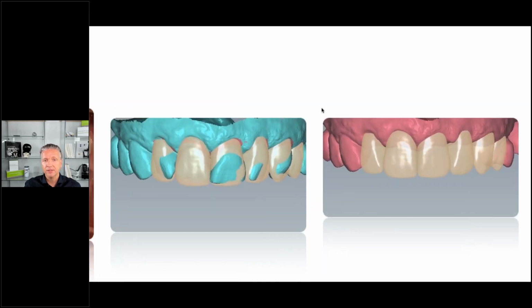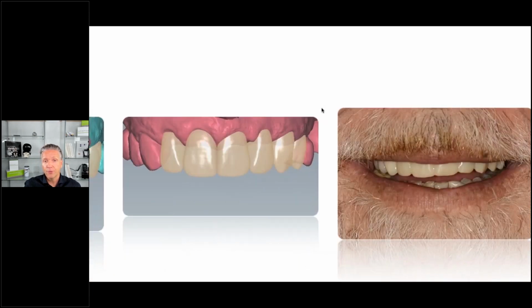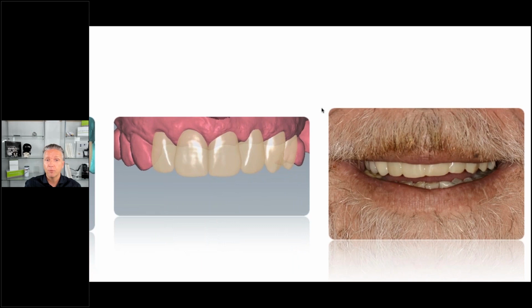It's just a quick planning to give the doctor the idea where we maybe have to prep more or cut more tooth structure, and what we maybe can leave untouched, just in enamel. In this case, it's a veneer case, so we definitely want to be careful that we're not prepping too much. We try to stay in the enamel for veneers, right? So we want to be minimally invasive. For a patient, I can show, okay, that is the smile we're looking into, the future outcome of that restoration.